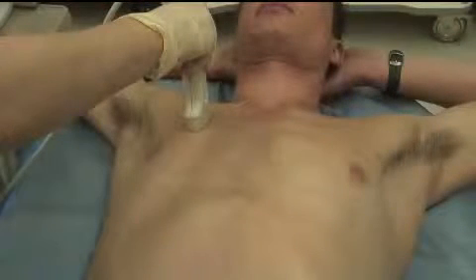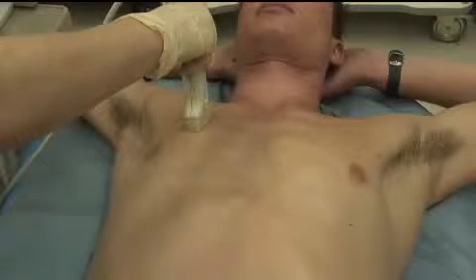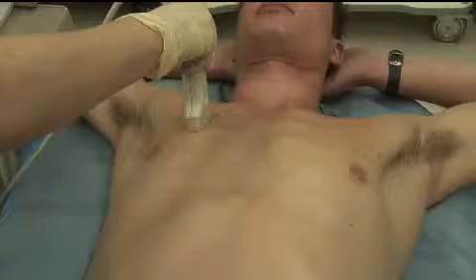Pneumothoraces may also be identified by the absence of the sliding lung sign. Evaluation of the right and left pleural spaces for pneumothoraces begins at the 3rd and 4th intercostal spaces in the mid-clavicular line. The unaffected side should be evaluated first. The probe should be placed longitudinally to include 2 adjacent ribs.